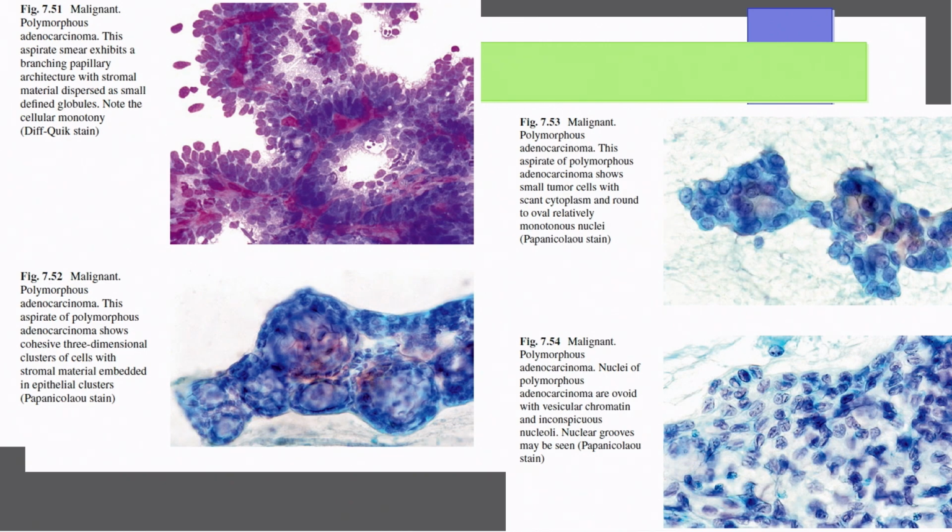You might be supported by a specific hotspot mutation in PRKD1, which is useful if you have material to perform on cytology too.